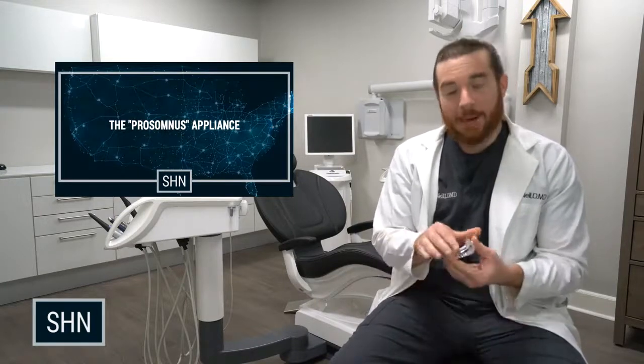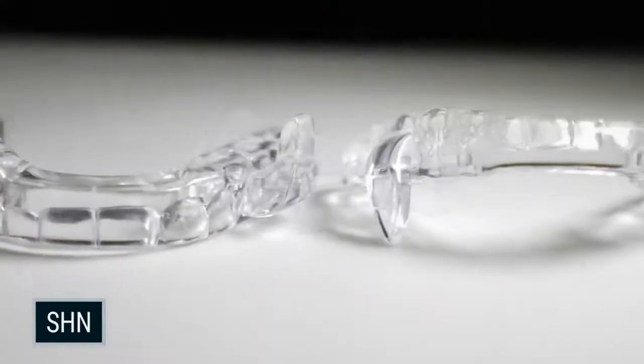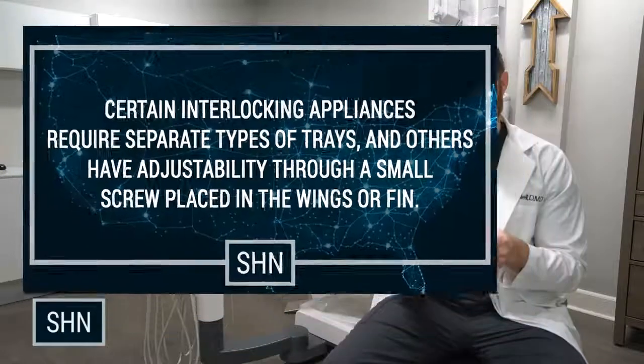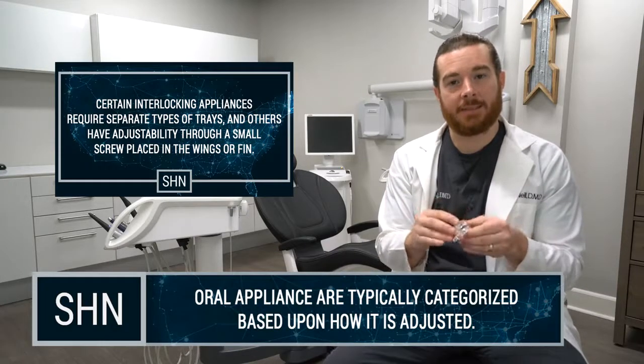There's an extralateral play that you can add on the side wings or fins. Remember, the appliance is interlocking. For the interlocking device, you're going to have these side wings or fins that are actually fixed to the appliance. They can be moved based upon ordering separate trays. The appliance is not actually connected, so it's different than other styles of appliances that are actually connected.